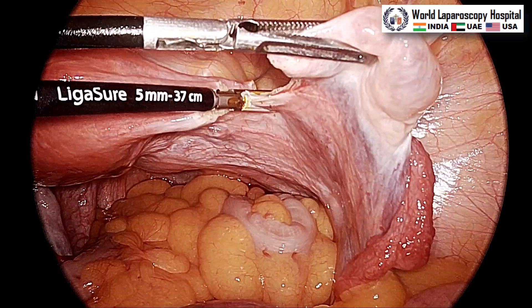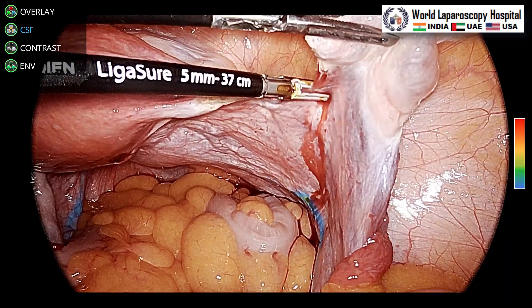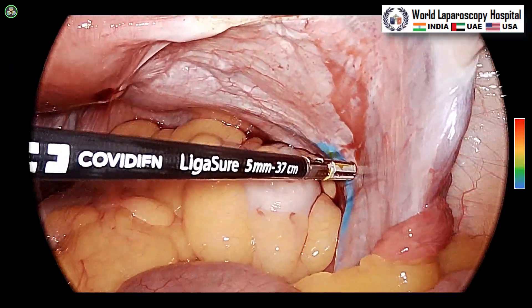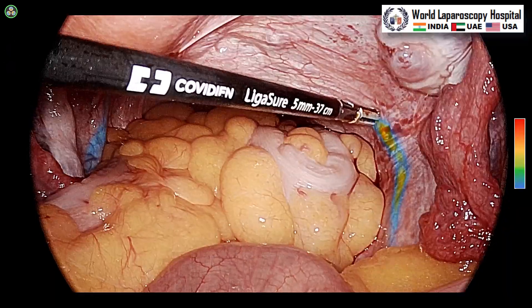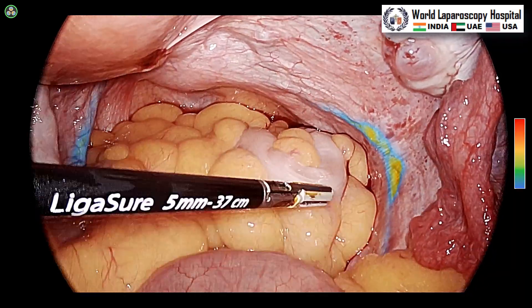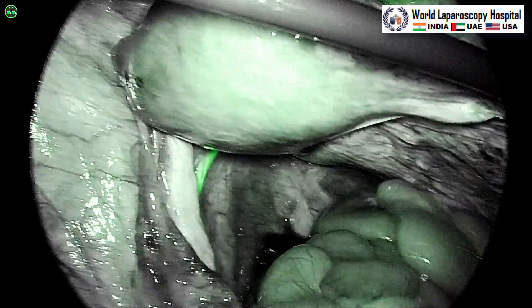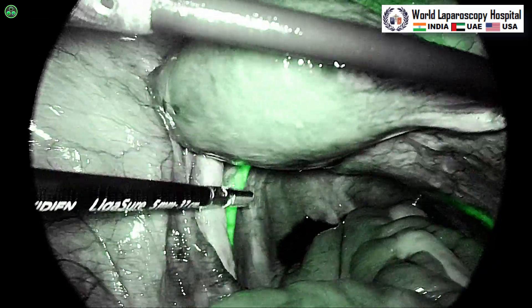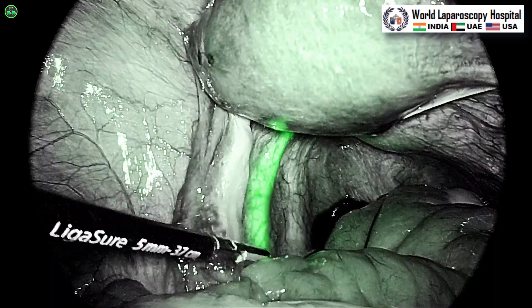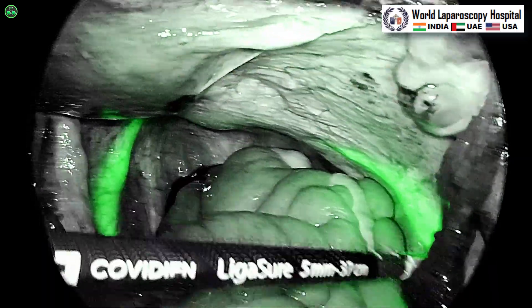The round ligament, fallopian tube, and ovarian ligament are taken. We have injected ICG and you can see this is the CSF mode. This is a beautiful mode of the 1788 where green indicates more ICG uptake and blue indicates less ICG uptake. You can have different contrast modes and there is also an ENV mode where the green color is very much highlighted without overshading other colors.